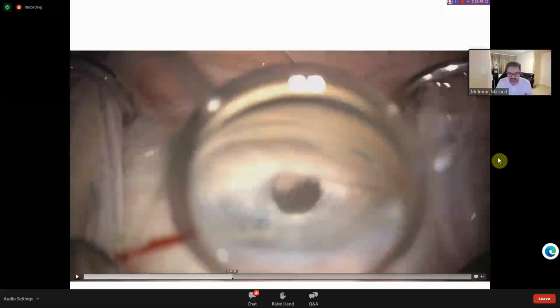So now the point about this angle is that because of the previous trabeculectomies, the patient has developed peripheral anterior synechiae, okay? So around the iridectomy, you can see that the angle is adherent to the trabecular meshwork, the iris is adherent. So what I'm using is a micro grasping forceps to conduct a very gentle direct goniosynechiolysis with the forceps. And now I can see the trabecular meshwork there, okay?